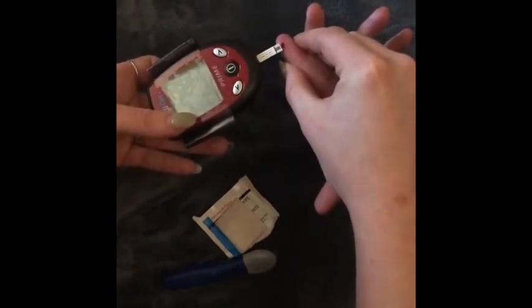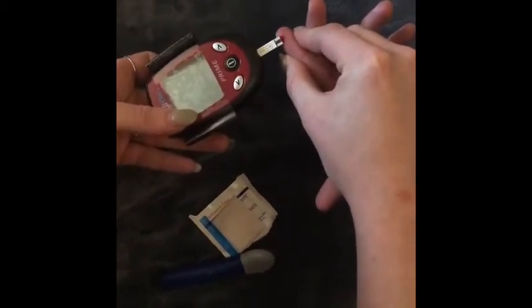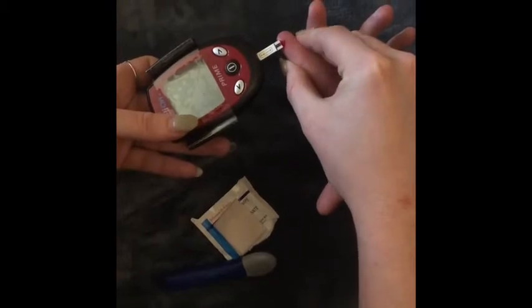Then squeeze out enough blood to fill up the strip until it starts blinking. You can then use a paper towel.